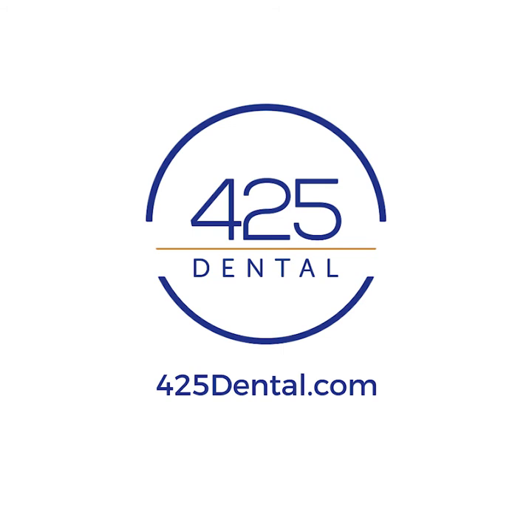Please note that the munchie we provide should last the duration of treatment. If you lose or break it, there is a $5 charge for a new one. If you begin to feel sore, don't worry. This is a normal occurrence with Invisalign. It is expected that you will feel sore for the first few days of every new aligner, but it should subside towards the end of use.